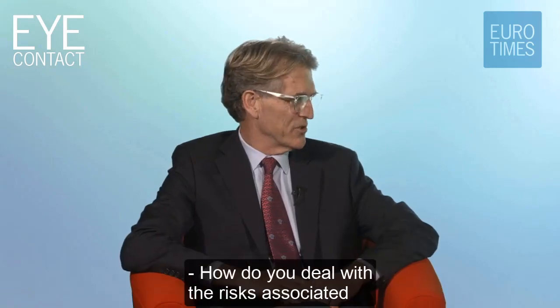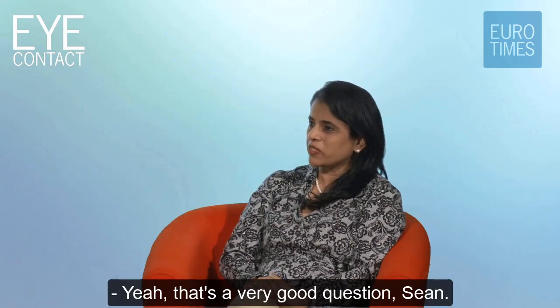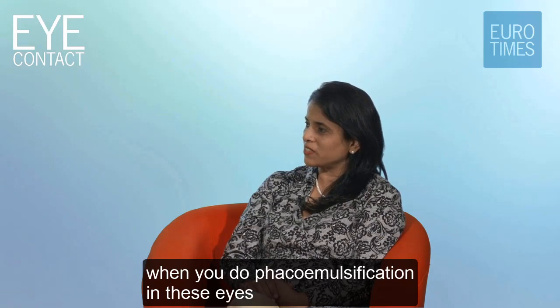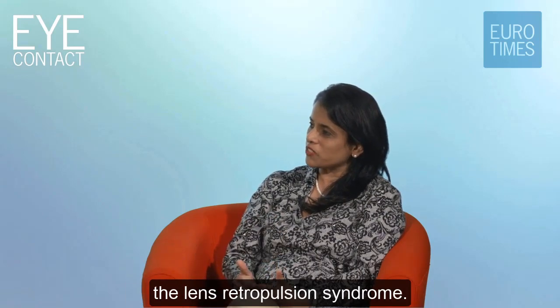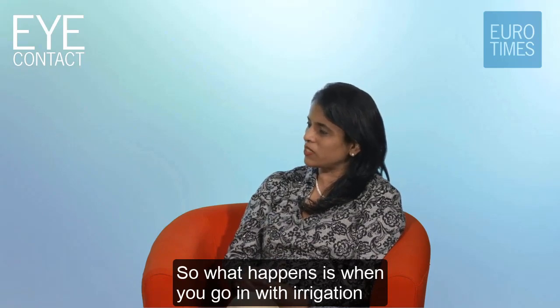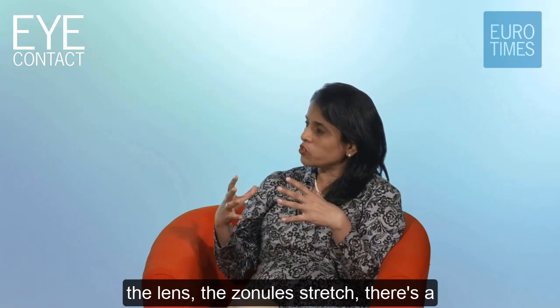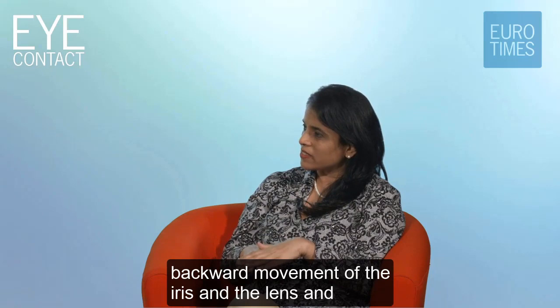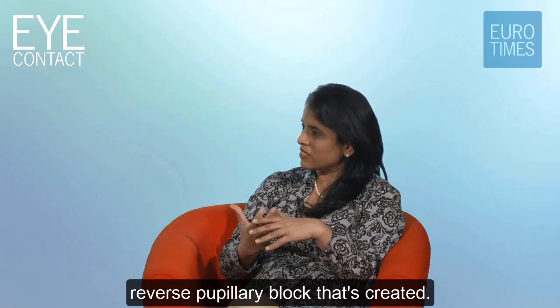Well, how do you deal with the risks associated with the anatomy of these eyes? Yeah, that's a very good question, Sean. These eyes are large, and there's a very peculiar phenomenon that happens when you do phacoemulsification in these eyes, and that's the iris diaphragm and lens retropulsion syndrome. So what happens is when you go in with the irrigation aspiration probe, the entire anterior chamber fills, the lens-zonules stretch, there's a backward movement of the iris and the lens, and that makes the anterior chamber very deep, and there's a reverse pupillary block that's created.